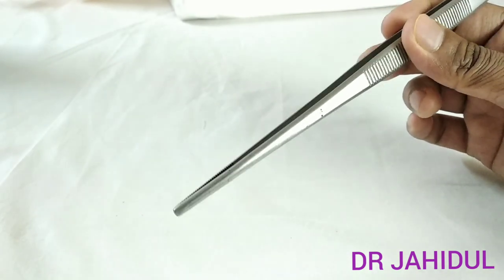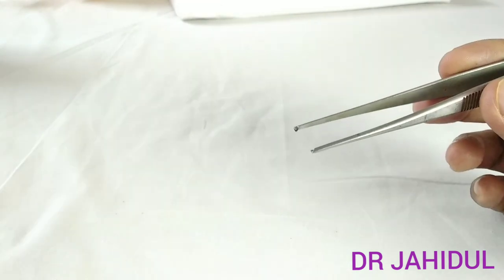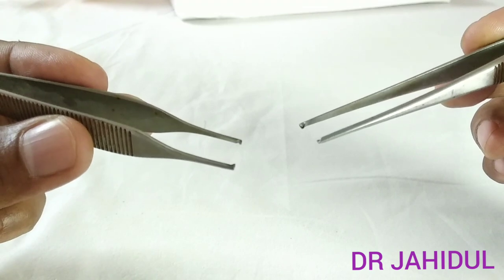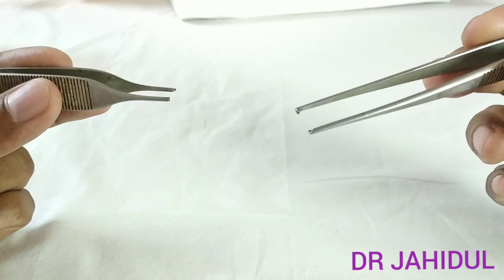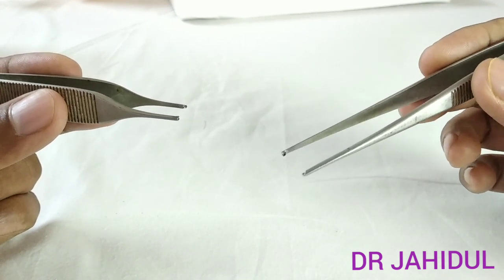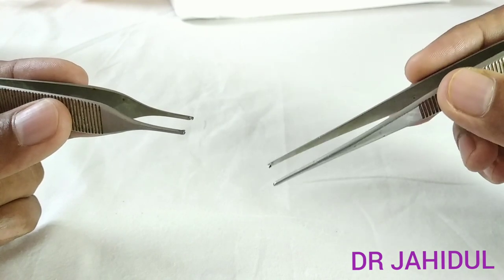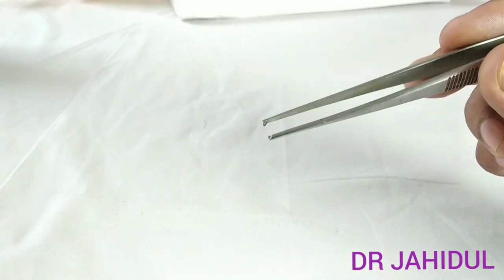The fine-tipped forceps is often used for nerve repair and vascular anastomosis. The toothed dissecting forceps has teeth and grooves at its tip to hold tough structures. The tooth forceps is used to hold tough structures like linea alba and rectus sheath. During skin closure, we hold the skin with this tooth forceps. We also hold the scalp for scalp closure and hold the prepuce for suturing during circumcision with this tooth forceps.